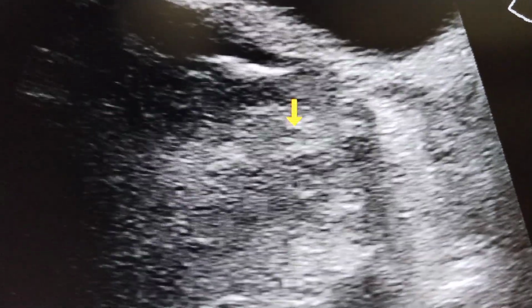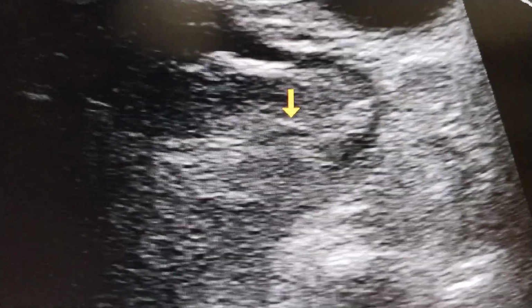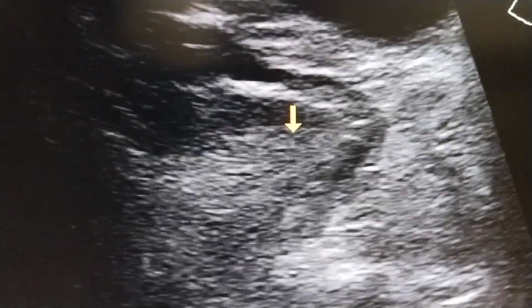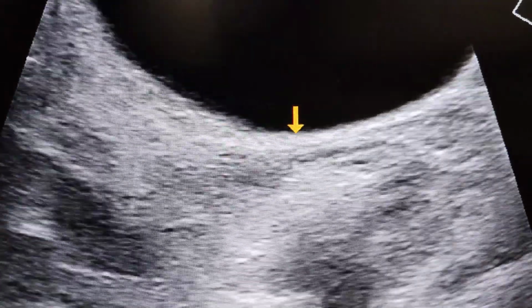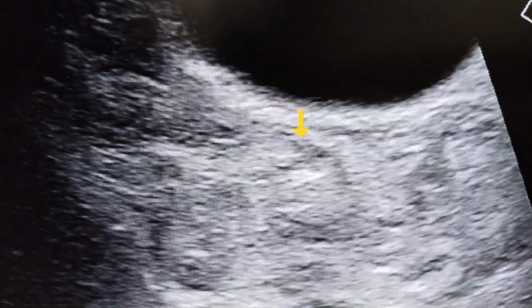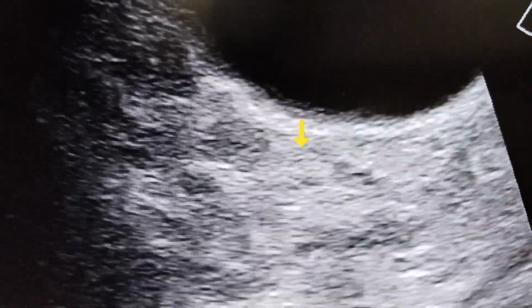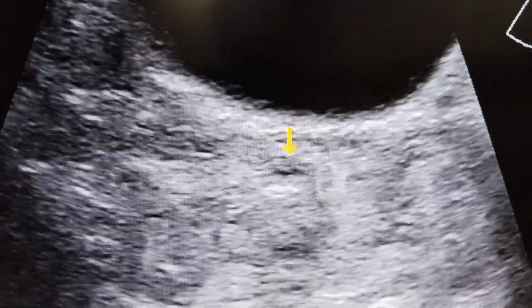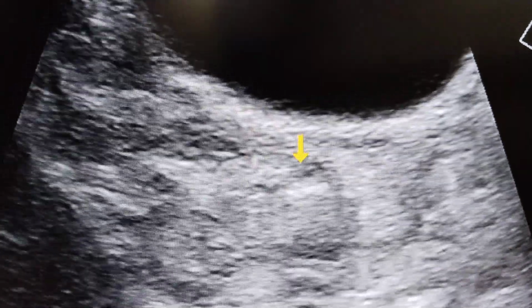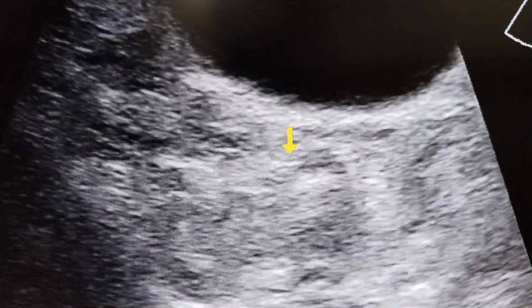This patient has got treatment for the last 7 years. Maybe due to the treatment, the rectum may have been spared from the disease process. We have seen that there is no skip lesion, meaning that no healthy gut is seen except the rectum in this disease process.